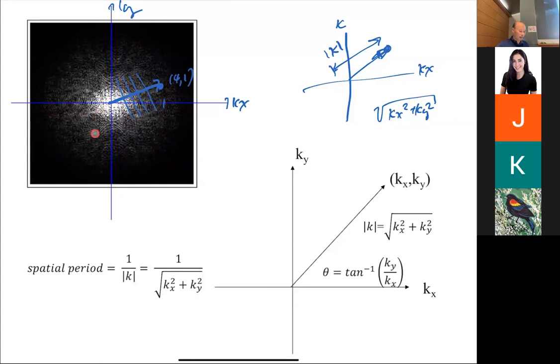So the design criteria are exactly the same for the trajectories, but just as a warning, and I'll emphasize later, what we do for spin warp is just one way of applying those criteria. If you apply those same criteria to the square spiral, you will not get the right answer, okay? Because what we do today is one application of those principles, but if you apply the correct principles, then that problem is going to be fairly straightforward, okay?